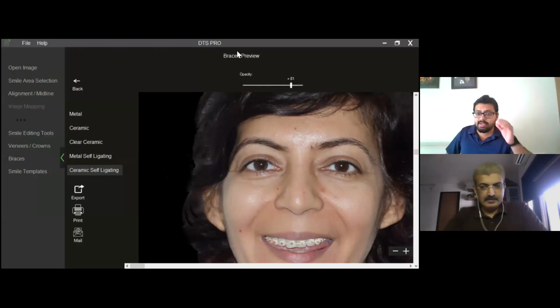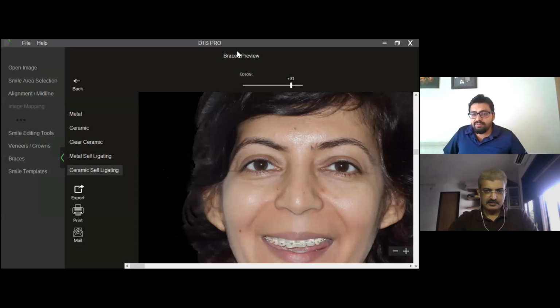Yes, we are already working on the 3D software. And would it support that 3D software? Yes, so you will be able to import facial scans as well. The facial scans typically are in the format of an OBJ. For 3D file formats, we typically have the STL format, which most scans use, and that's a colorless, black and white format. Whenever you have color, it would be either PLY or OBJ. These are the two typical formats that would come to us.